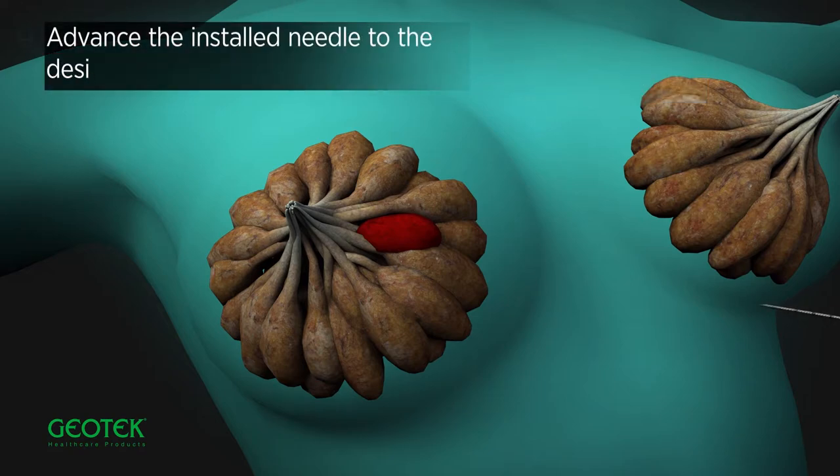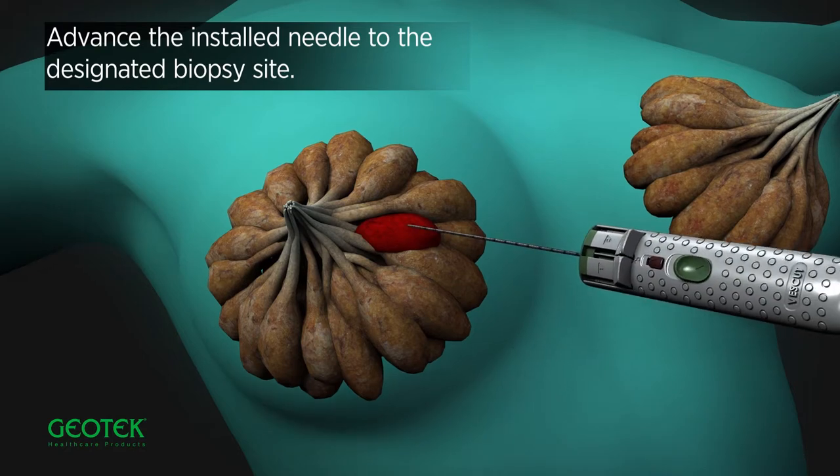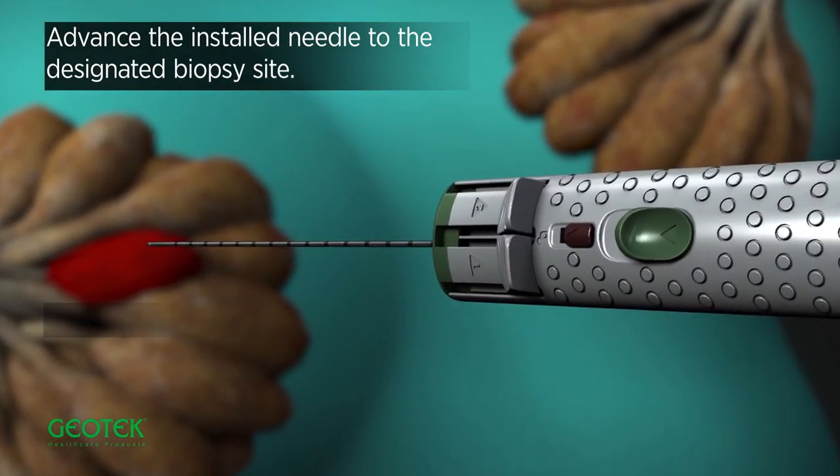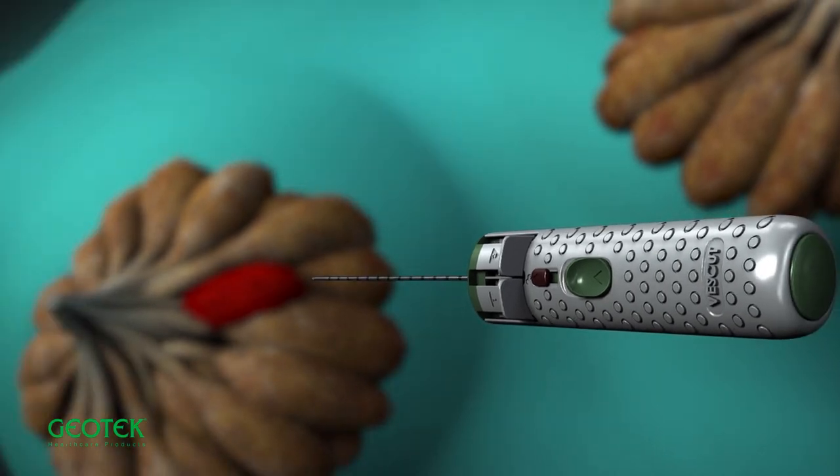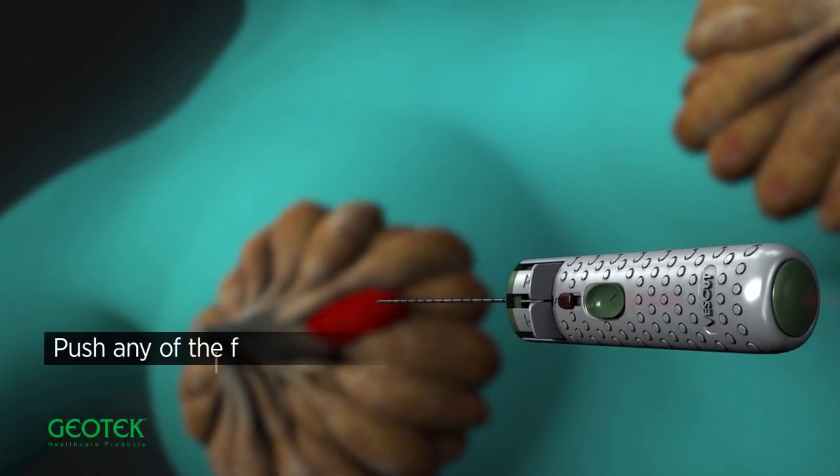Advance the installed needle to the designated biopsy site. Push forward safety before firing. Push any of the firing buttons.